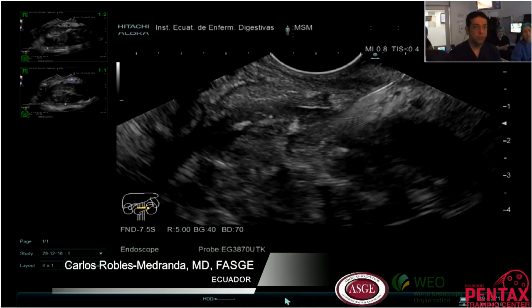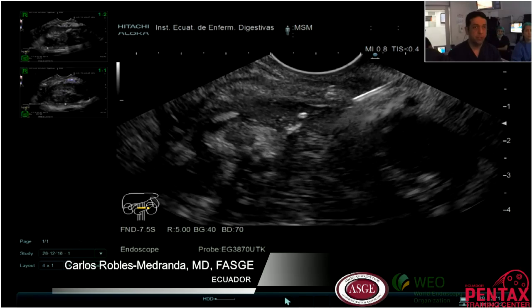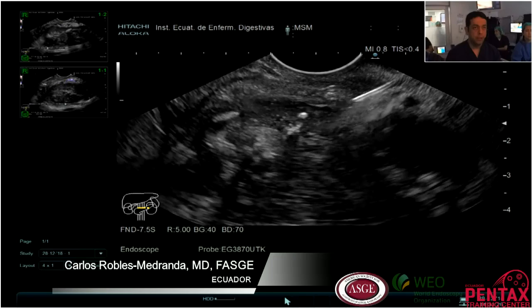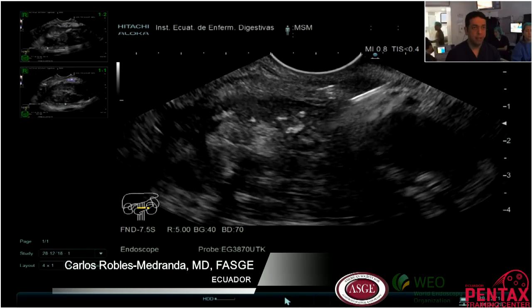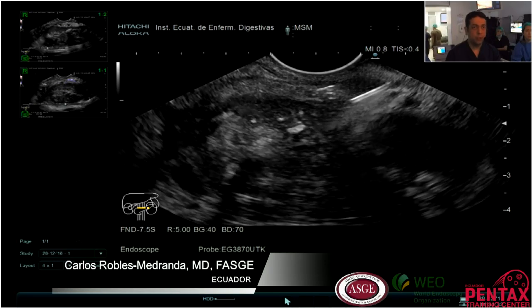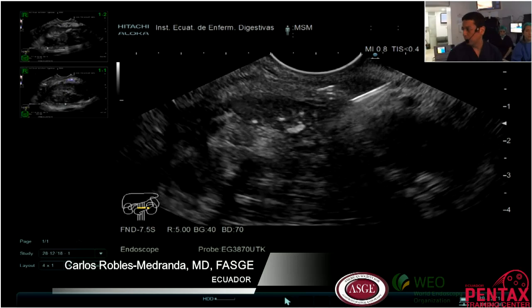Go, sigue. And I am in a very good position now. I feel comfortable. I am sure that I am inside the pseudocyst, and I will use an Axios, but probably my Axios, voy a usar el de 15. Huh?